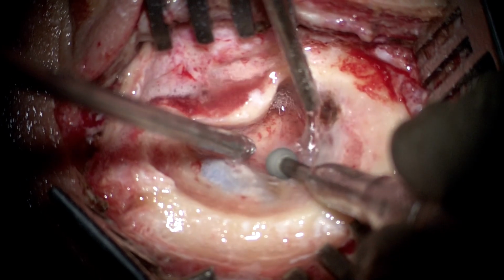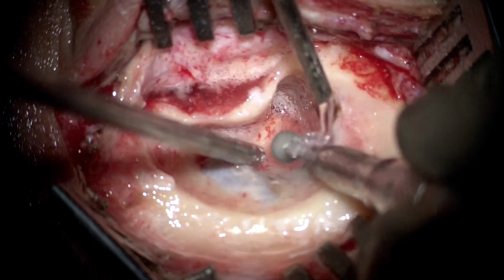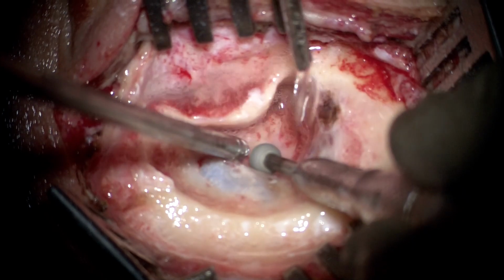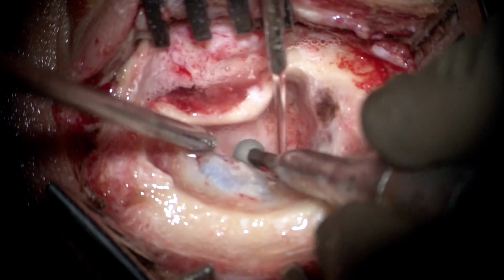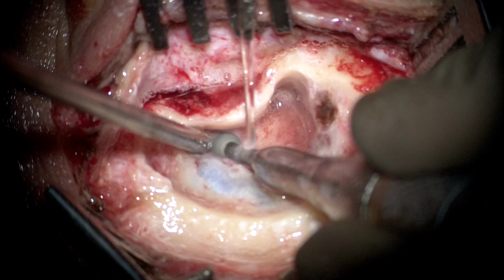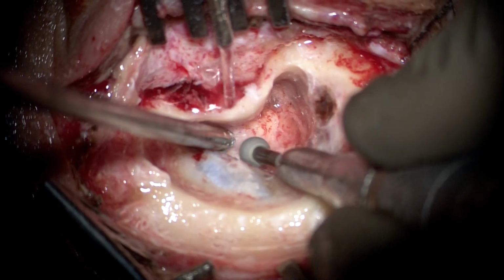So with this step, the most medial part of the sinodural angle is now being decompressed quite generously using the same diamond burr, because the field of vision has suddenly increased due to the posterior falling of the exposed sigmoid sinus. And we can see how we have suddenly gotten an increased space to drill in front of the sigmoid sinus, behind the posterior canal wall.